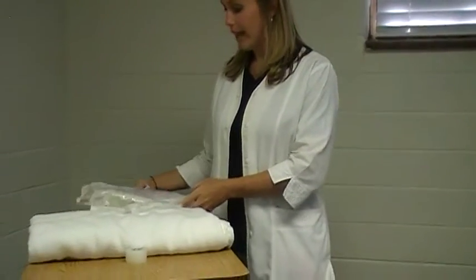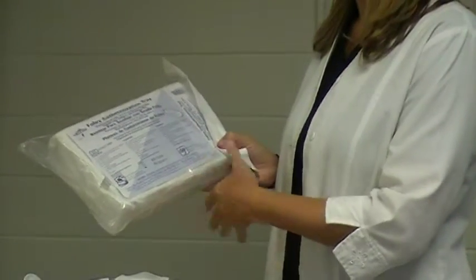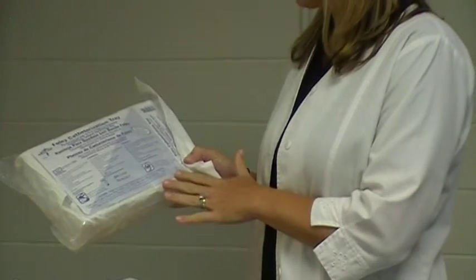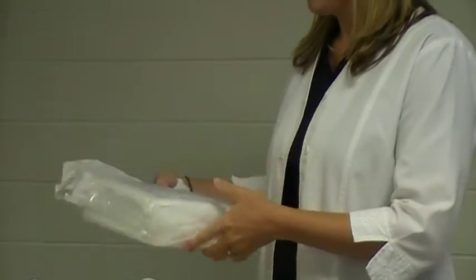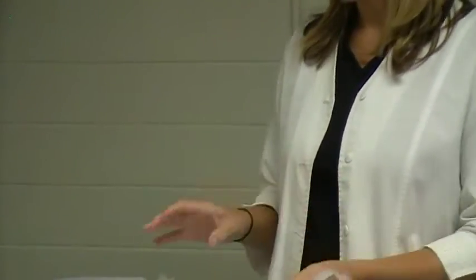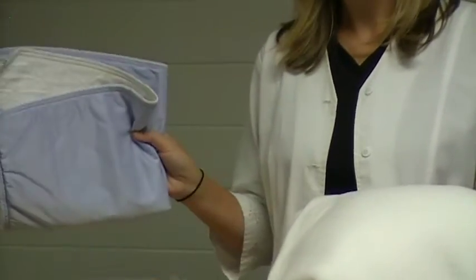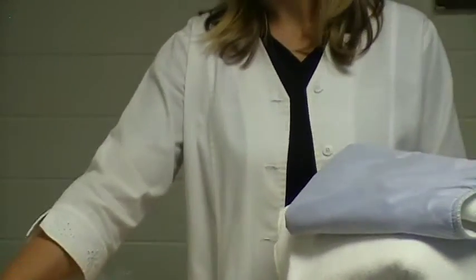The first thing we'll go over are the supplies that are needed. You will need a Foley catheterization tray — different facilities and companies have different packages, so check your contents. You will also need clean gloves, a bath blanket, a waterproof pad, and some tape to use at the end.